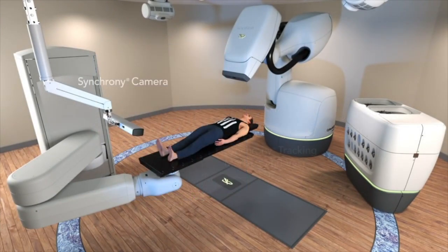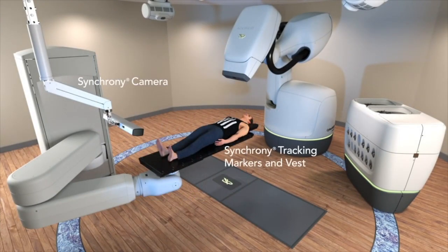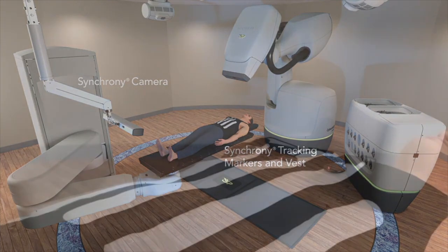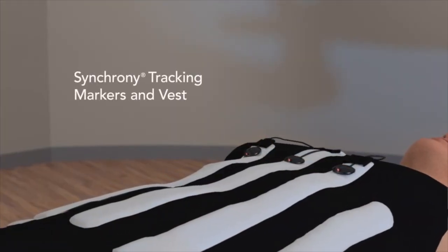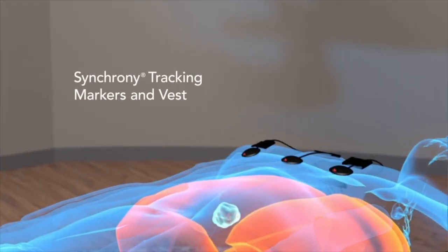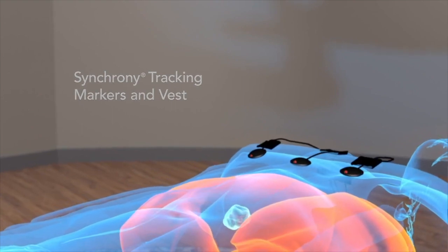For tumors that move with respiration, the Synchrony Respiratory Tracking System monitors the patient's breathing motion in real-time with an optical camera and LED markers placed on the patient's chest.